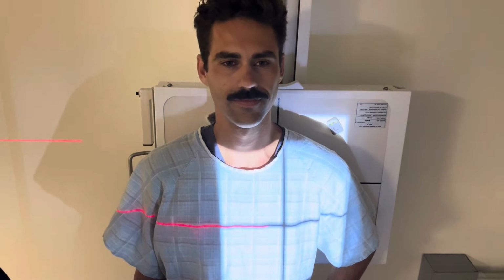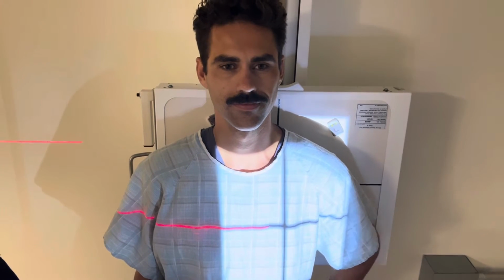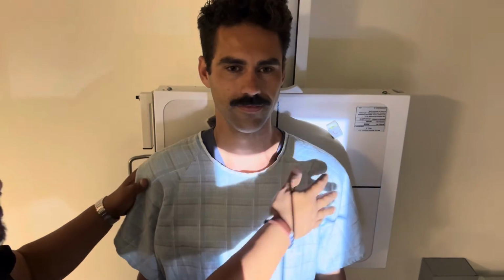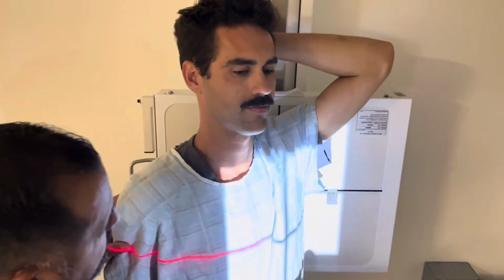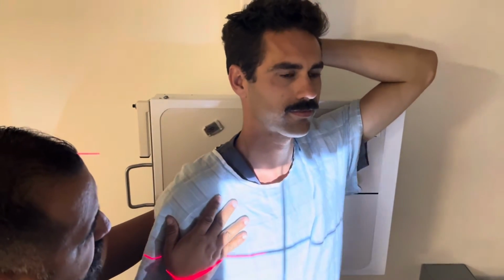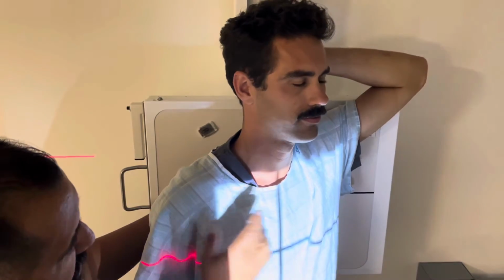All right, so now we're going to go ahead and do an LPO, left posterior oblique. So we're going to turn at an angle here. You're going to raise this arm up. Okay. I'm going to put this left marker right over here. Again, we're rotating the patient at a 45-degree angle. All right. I want that line to come down here, and we're focused on the left posterior ribs. So he's at an oblique position here.